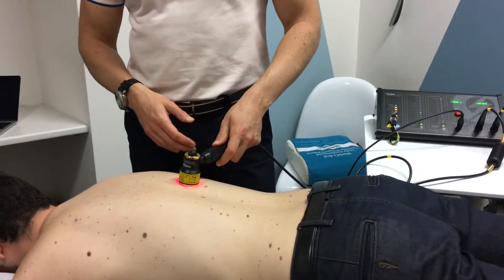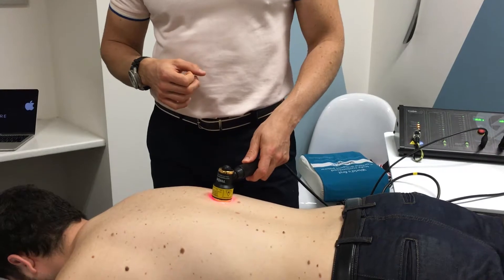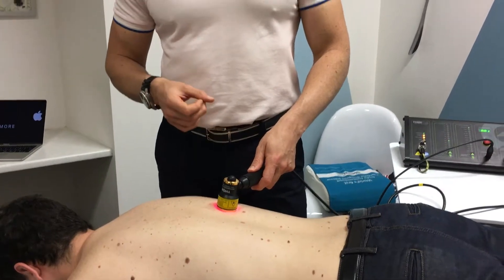Lou will most likely not be feeling much at all — at the most he might feel a warm tingling sensation. Do you feel anything at the moment Lou? Yeah, it's a little bit warm. Okay, so it is largely a passive technique and that's perhaps the most unsatisfying aspect of it from the patient's perspective.